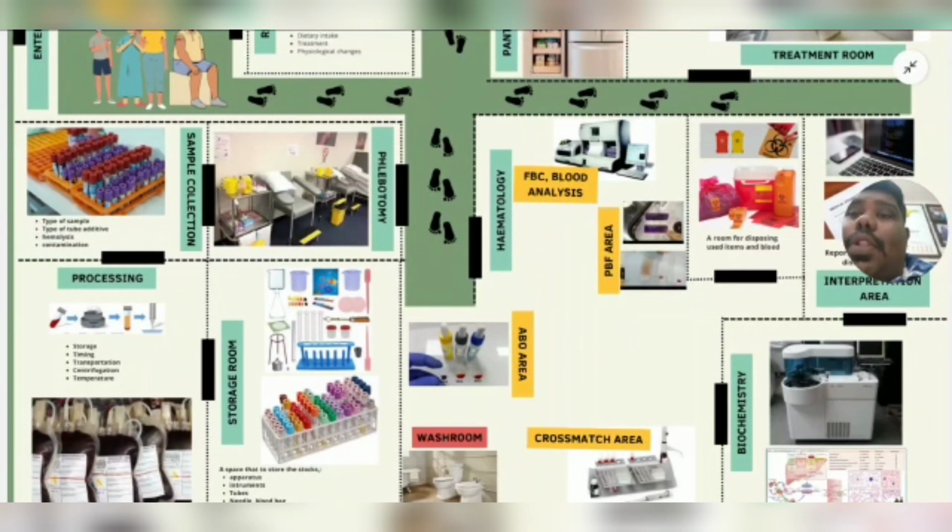And for hematology, there will be the machines that we use for the interpretation of the full blood count. It will be placed in an area where there is no water leakage, which is very important.